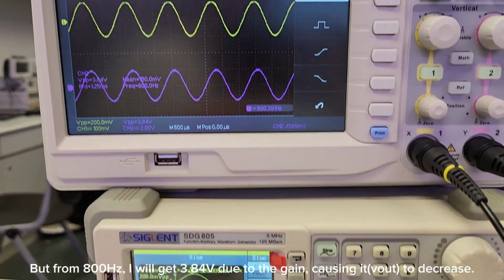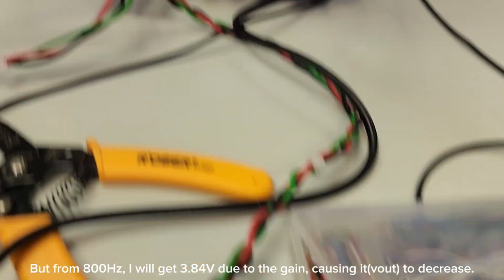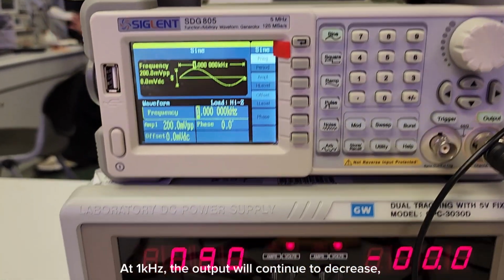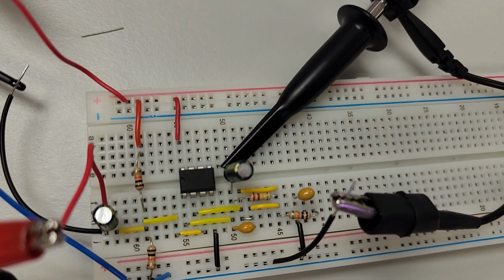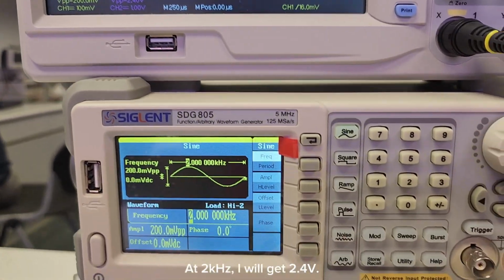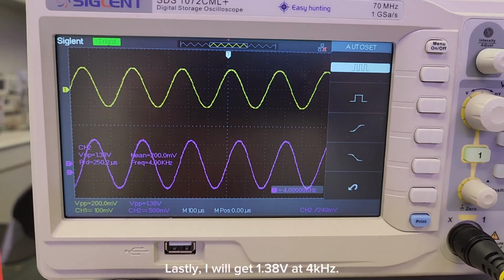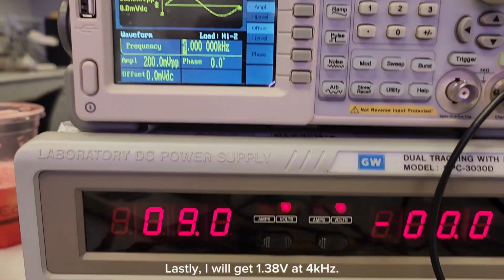By 800 Hz, I'll get 3.84 volts due to the gain causing it to decrease. At 1000 Hz, the output will continue to decrease to 3.48 volts. At 2 kHz, I'll get 2.4 volts. Lastly, I'll get 1.38 volts at 4 kHz.